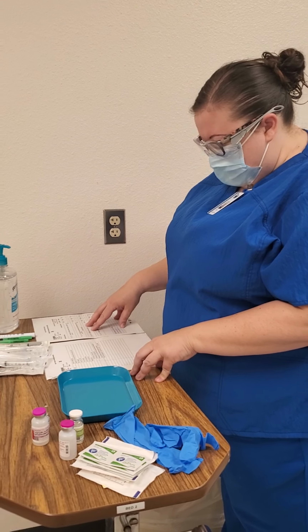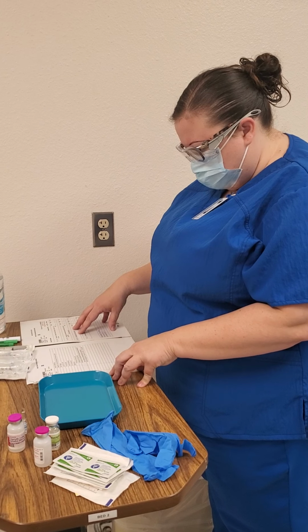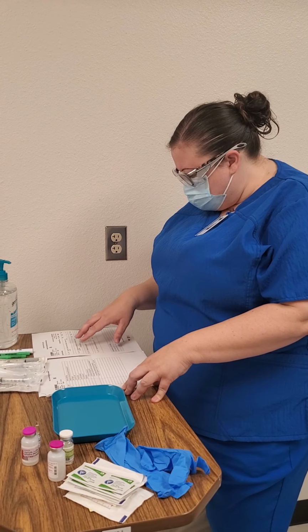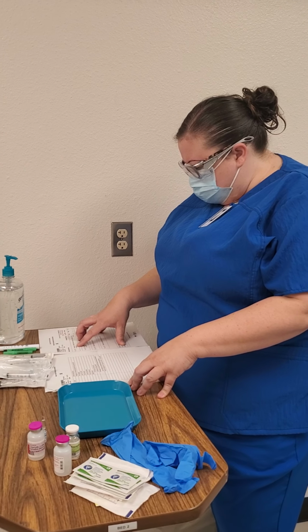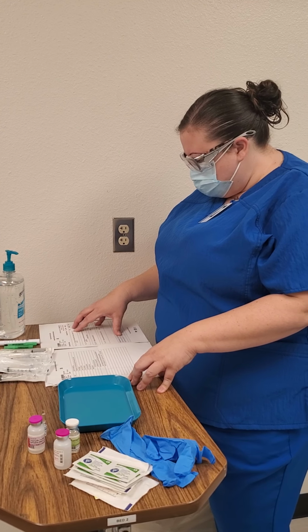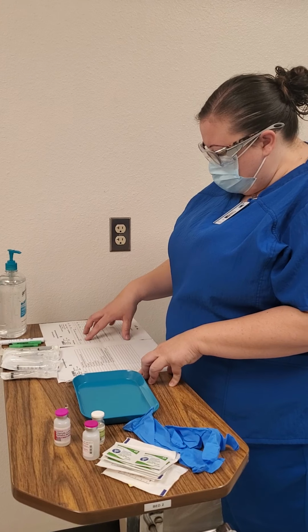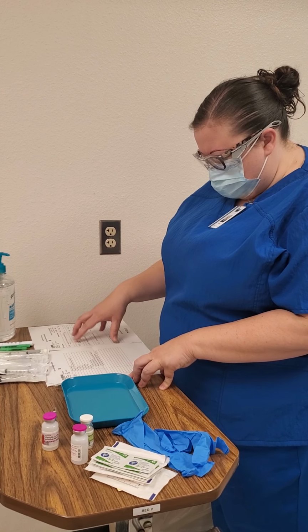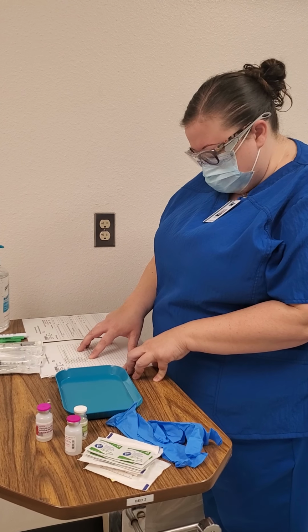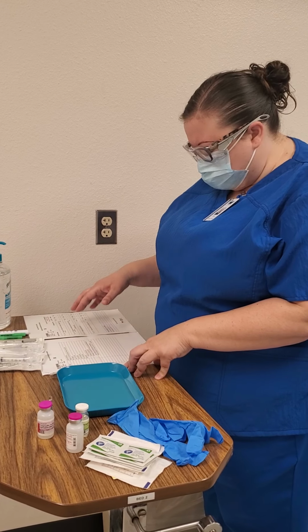So it looks like she's here with a diagnosis of community-acquired pneumonia, and she first will be getting the tuberculin purified protein derivative diluted at 0.1 milliliters, and that's just a one-time thing that it's administered. It has on the doctor's orders the PPD, which is the tuberculin TB test, on the right inner arm.